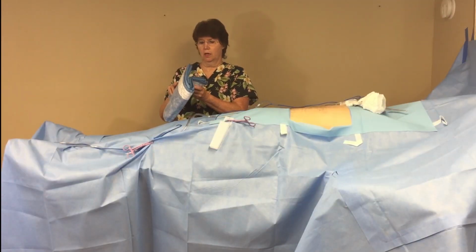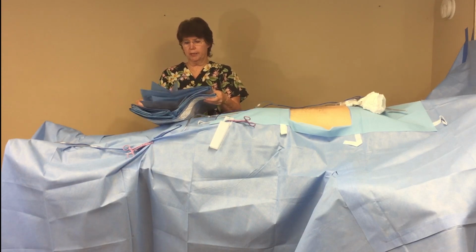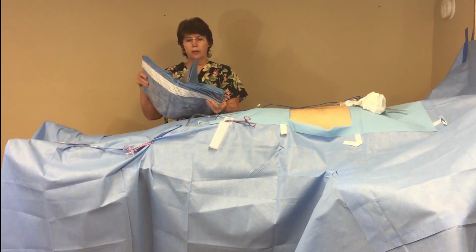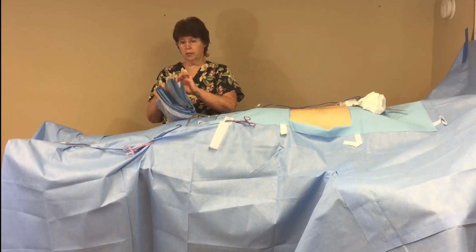So you're going to take the sheet, and I'm going to have to play both parts, so you may not see everything lie down like it would normally. There's someone on either side of the table, so there would be two of us working on this.